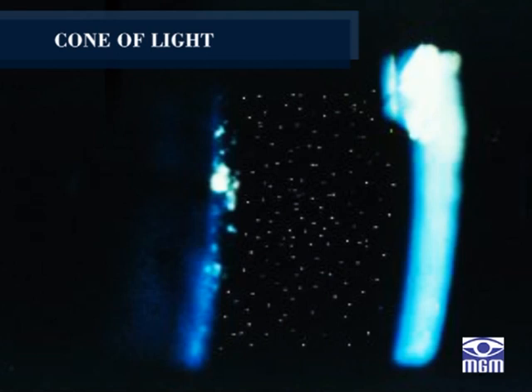The anterior chamber is considered optically empty as its contents do not reflect sufficient light to express the beam in the normal state. The cells and protein, if present in response to local inflammation, can be readily seen when isolated within the well-defined narrow tunnel of light produced by pinpoint illumination.